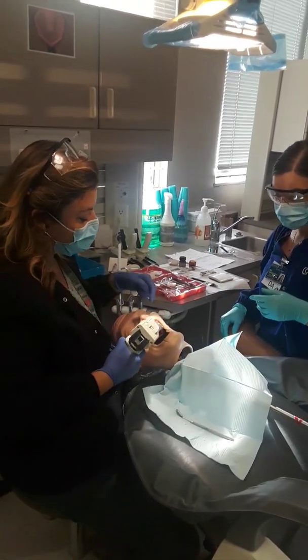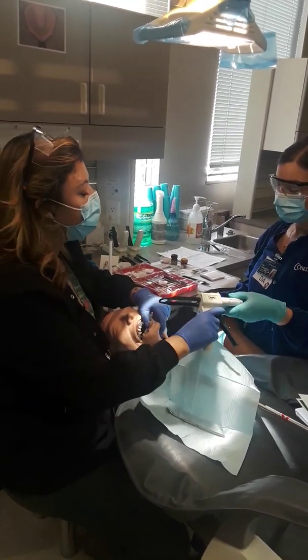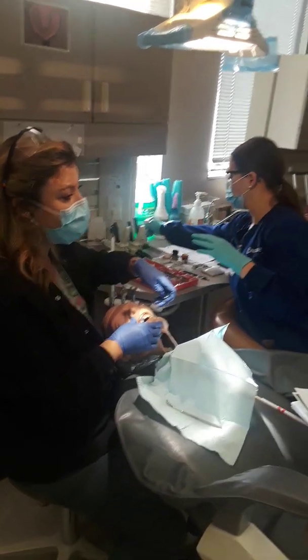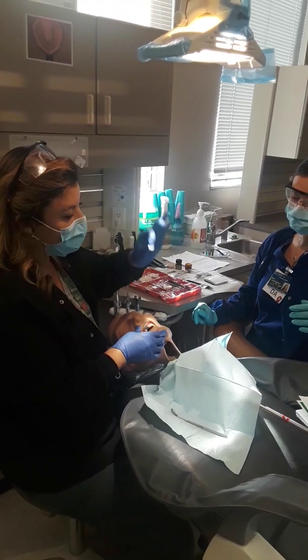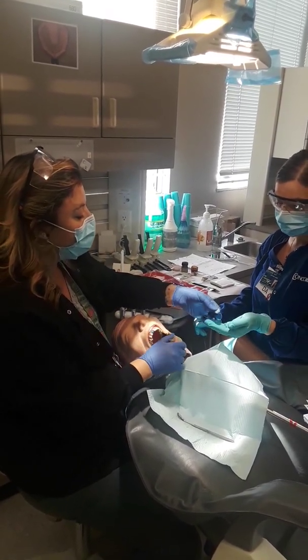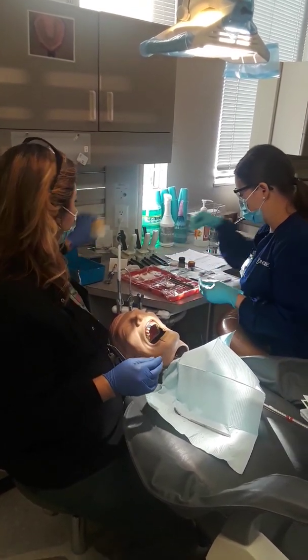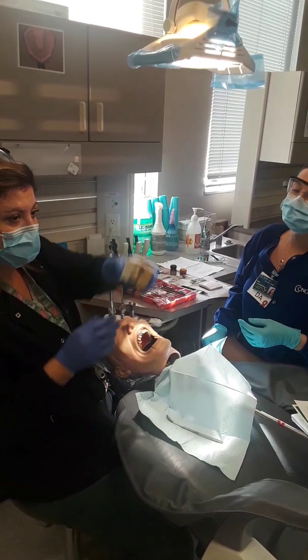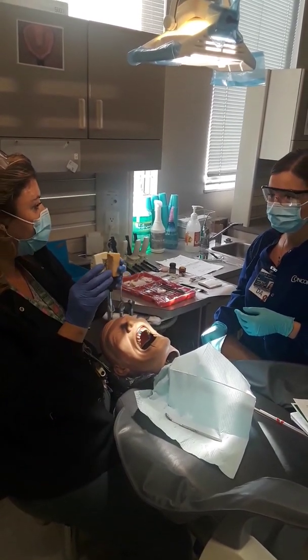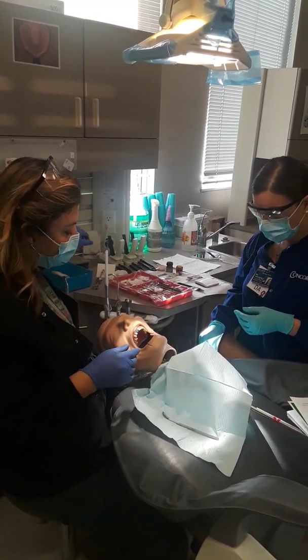Now we're going to put this on the teeth and have the patient bite together, because now this is going to show the lab how this patient bites together. So it's going to look like this. And that takes about a minute. That looks good. So the lab's going to fabricate this: the upper jaw, the lower jaw, and exactly how they bite together. This one's posterior, but it'll look the same.